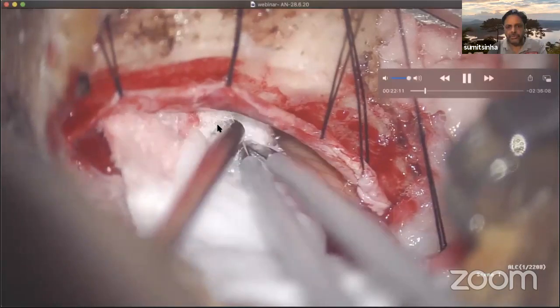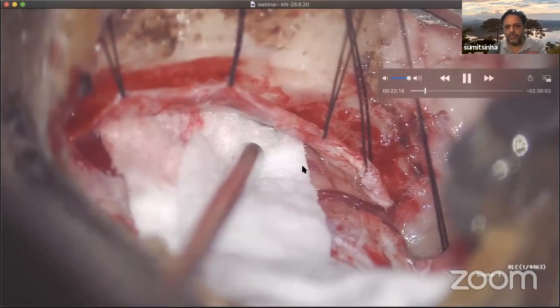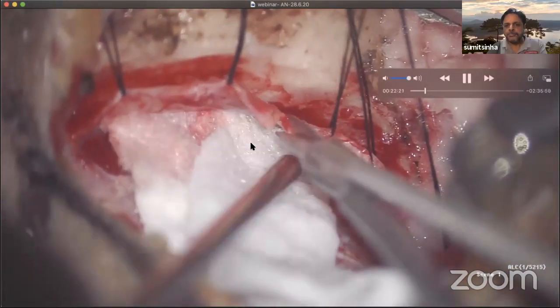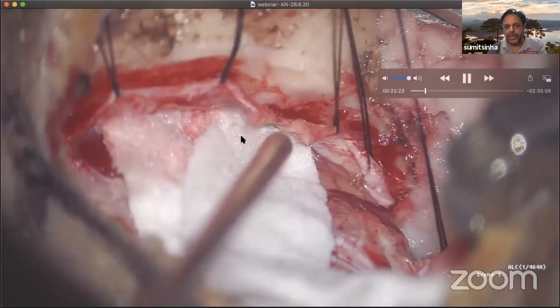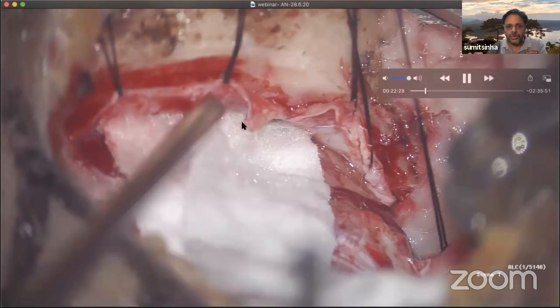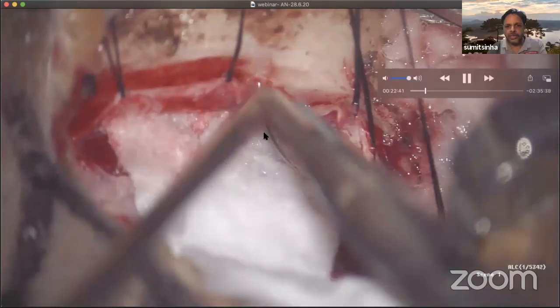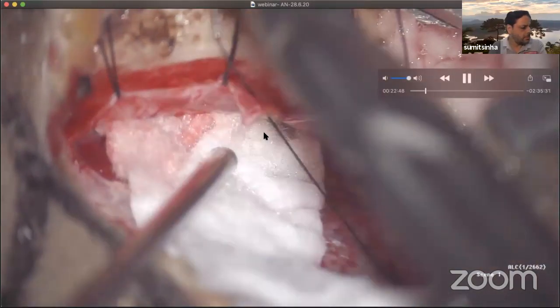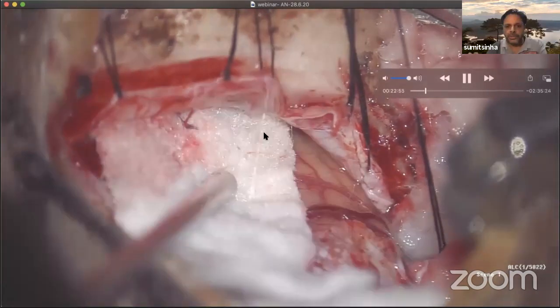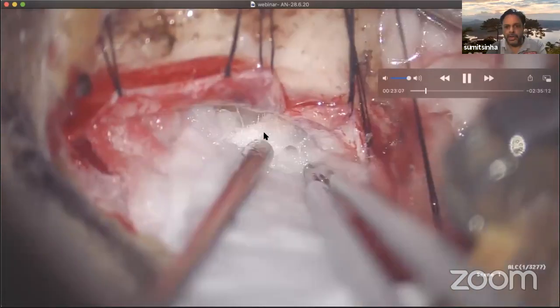Now you are on the cerebellar tissue. Protect the cerebellar tissue with cotton patties, and you may choose to electively put gel foams over here, and over the gel foams you put the cotton patties, so that your retraction does not damage the cerebellar tissue at any point during the surgery. So, lifting up the flaps of the dural flap, and there you see the tumor there. Some more CSF coming out.